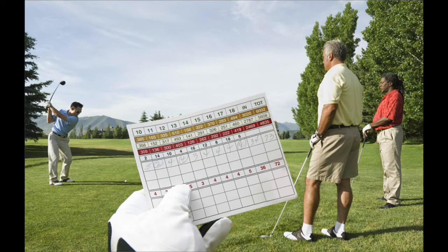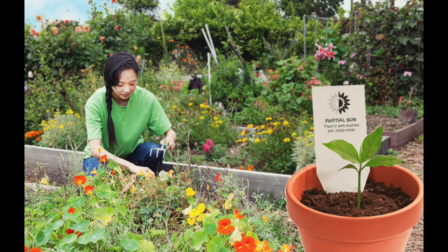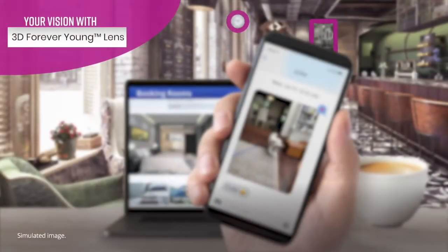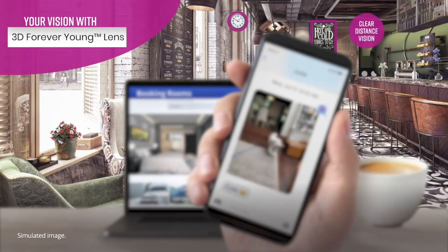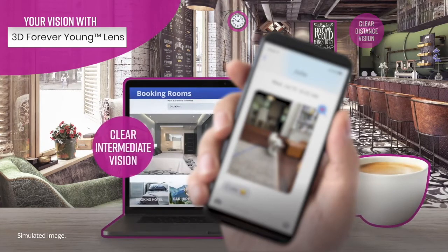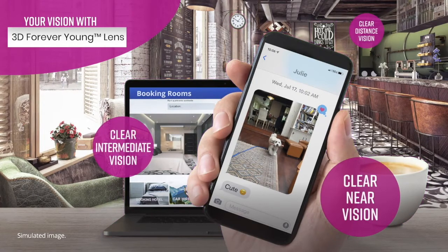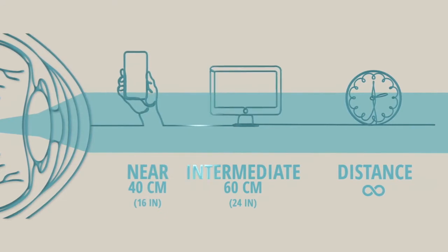Some patients do qualify for advanced lenses that can help correct the vision to different degrees. One of the lenses that we can use after cataract surgery we refer to as the Forever Young lens. The specific type of lens is called a multifocal, or even more specifically, a trifocal. The trifocal lens is designed to correct vision at multiple distances, in particular achieving a good level of far vision for things like driving, watching television, watching movies. Intermediate vision, things like seeing your computer screen, seeing a dashboard of a car, things like that. And close vision, things like looking at the cell phone, looking at a newspaper, looking at price tags. So the lens has a dynamic range to it, allowing for the vision without glasses at those three distances.